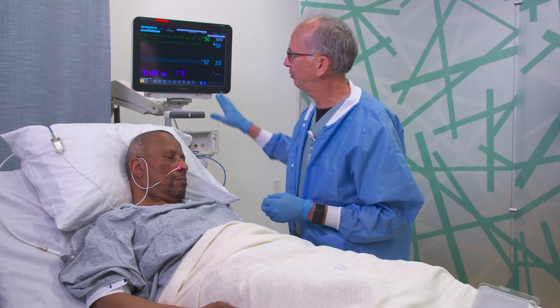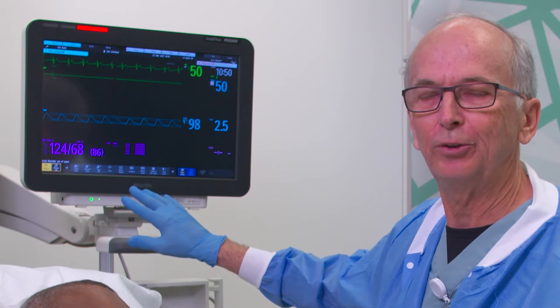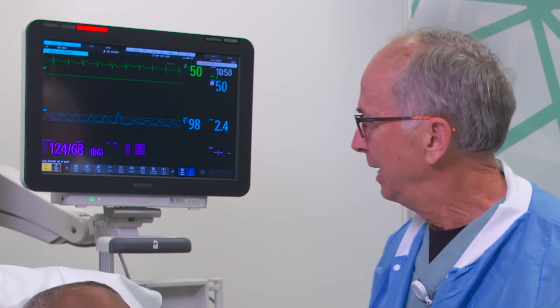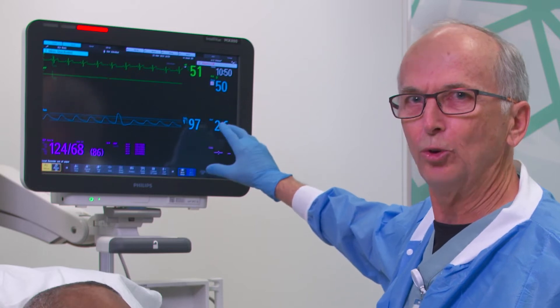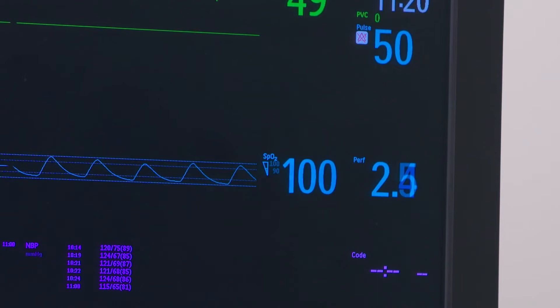You get an indication, if you set your monitor up properly, as to the magnitude of the signal. The bigger the signal, the better what we refer to as the signal-to-noise ratio. In this case, his perfusion index — this is a unitless number — is 2.4. We consider 0.3 or higher to be an adequate number.